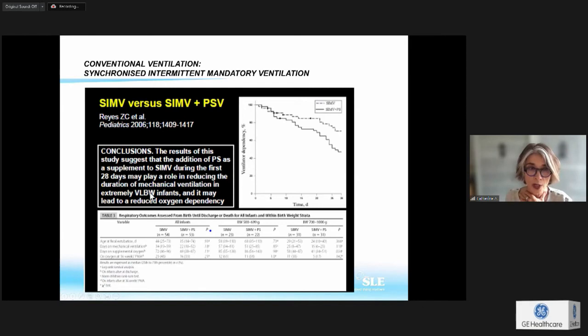And this one is shown actually in the studies where they compared SIMV to SIMV plus pressure support. And what they saw is that they were decreasing the number of days of ventilation, so the exposure to ventilation for the patient, when they were combining SIMV plus pressure support. So with this one, you have to be careful because it's more complex when you wean the patient. You might decrease the rate, you might decrease the PIP of the pressure support. So be careful because here it might take more time to wean the patients.